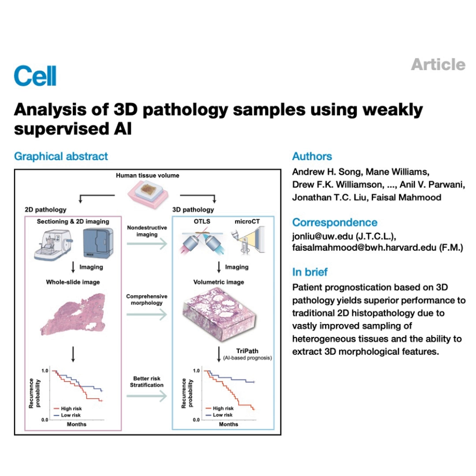Yeah, it sounds almost like magic, but it's down to a really clever AI approach. The core idea is weakly supervised learning. You might also hear it called multiple instance learning, or MIL. Weakly supervised. Okay. Less input needed. Way less. Think of it like this. TriPath doesn't need someone to painstakingly draw circles around every single cancer cell or grade every single patch. That would be impossible with this much data. Instead, it only needs the overall patient outcome, the big label.